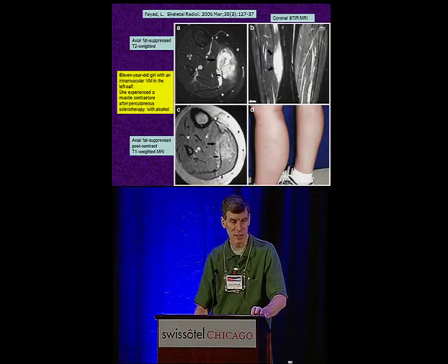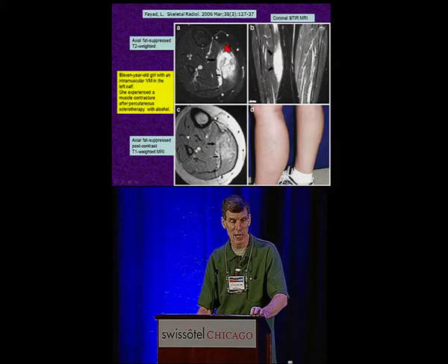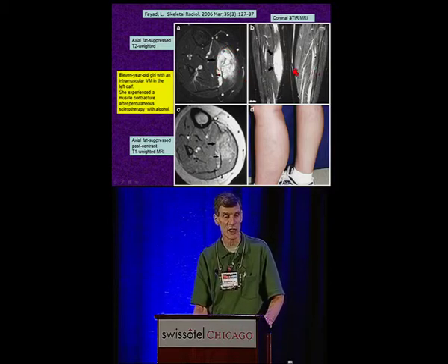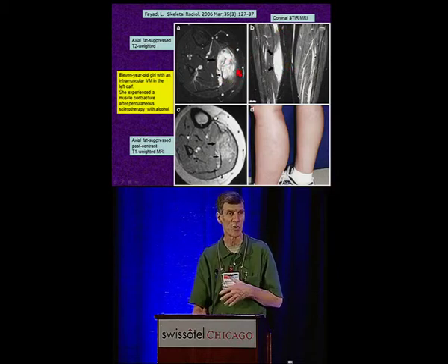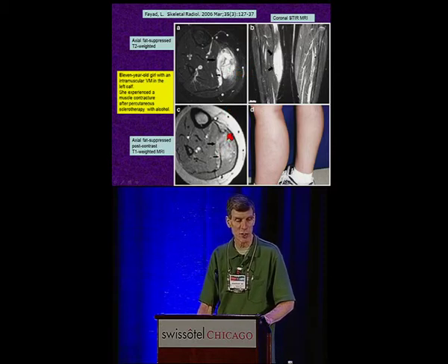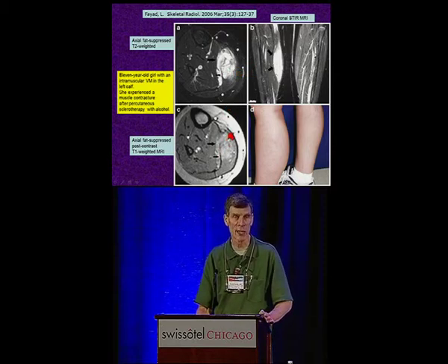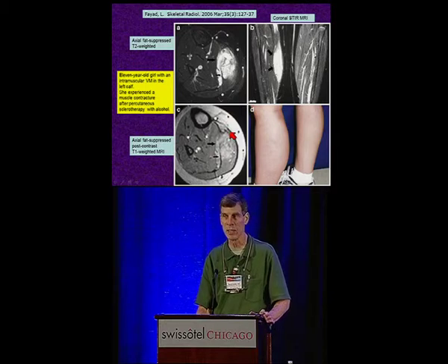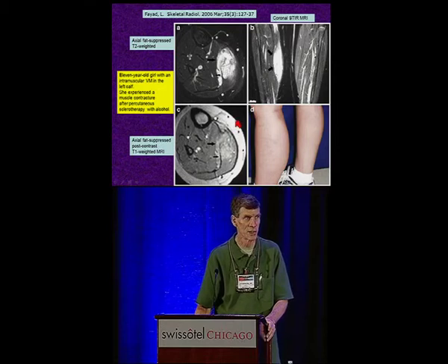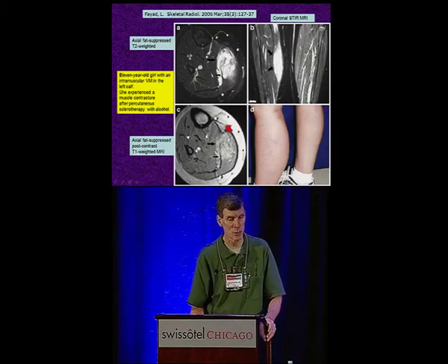As you can see in this MR picture, the T2 weighted high signal intensity lesions are the classic low flow lesions. You can see their extent, you can see what part of the tissues they involve, either subcutaneous, intramuscular. And if you're particularly worried, which we were not in this case, we got this accidentally because the person that protocoled had ignored our protocol suggestions to simply do a T1 and T2 sequence.